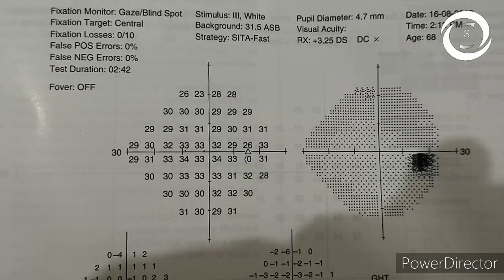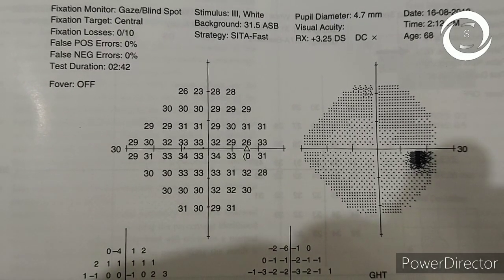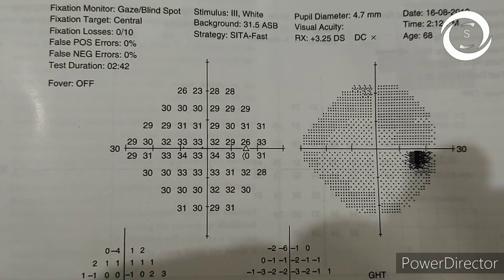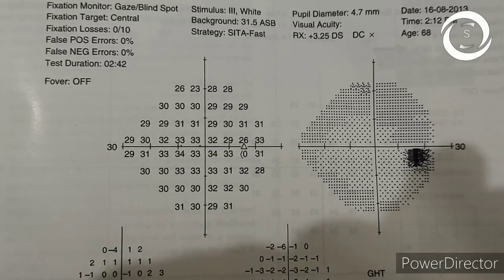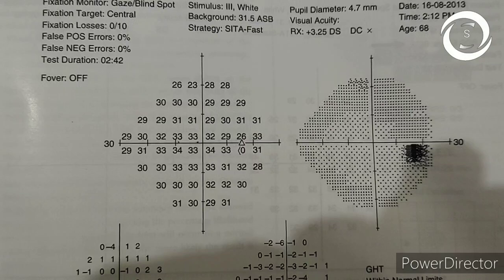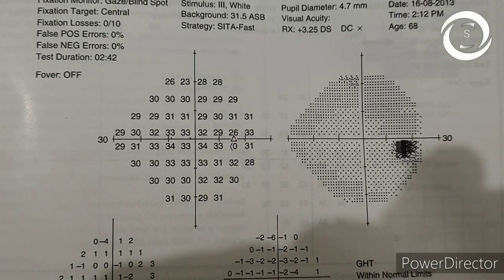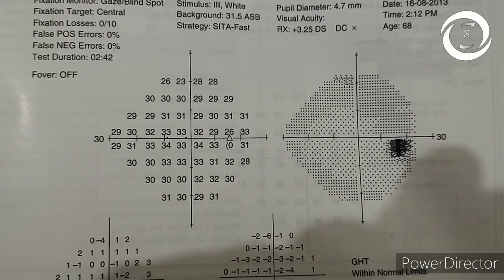Now, the first thing in the visual field you should check is the reliability indices. This test is highly reliable — fixation losses, false positives, and false negatives are all zero. Test duration is 2 minutes 40 seconds, so it is a fast test. The strategy is SITA Fast.